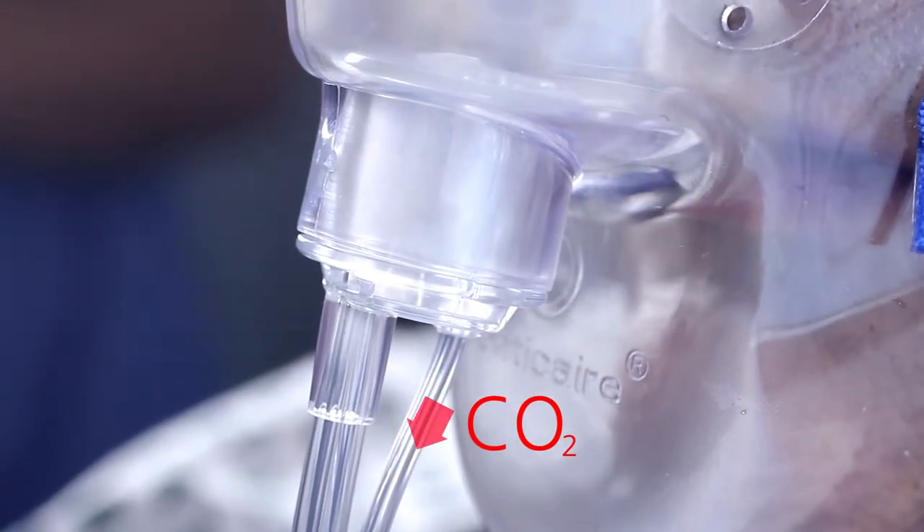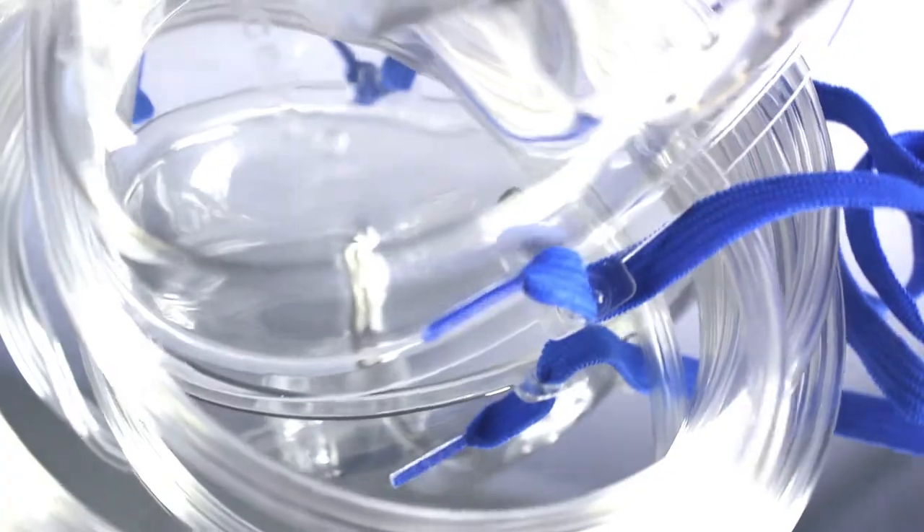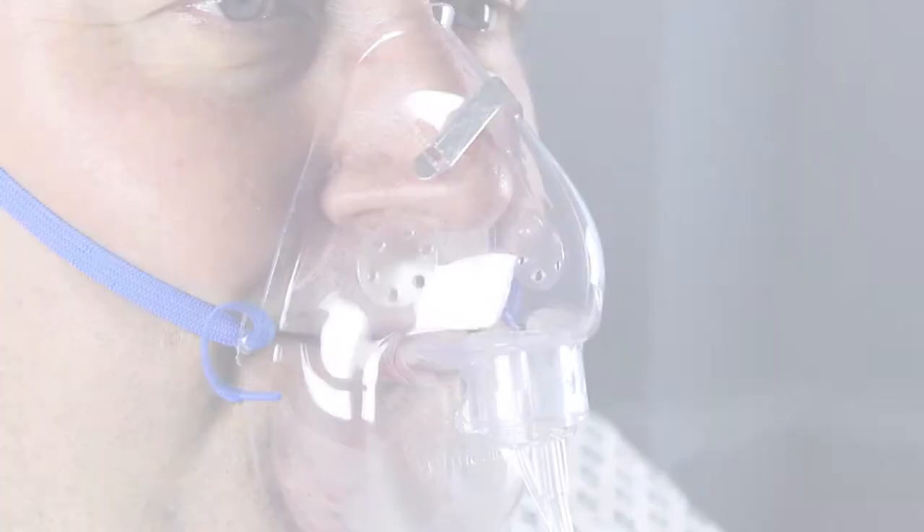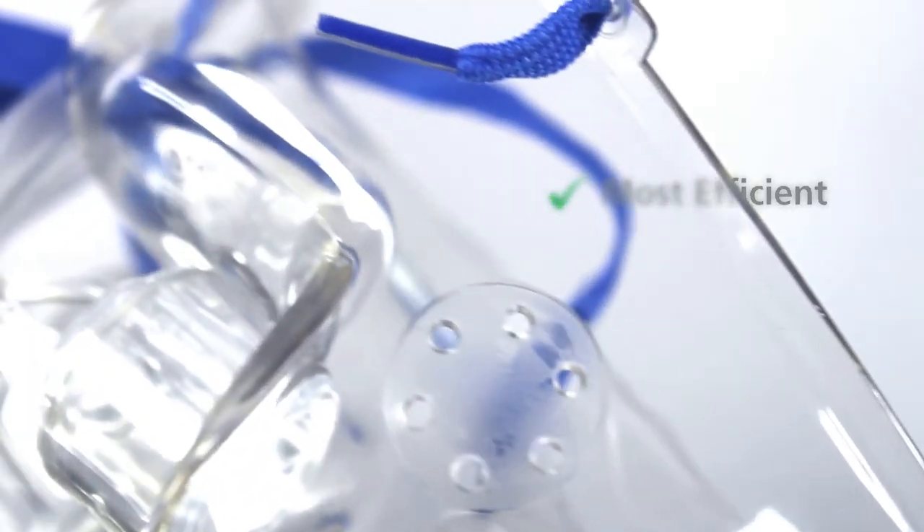The dual oxygen mask provides continual monitoring of carbon dioxide being exhaled from the mouth and nose, whilst administering oxygen to the patient. The integrated oxygen and sampling line provides quick and simple operation. Adult dual masks are also available with a nose clip. The dual mask from Flexi-Care has been proven to be the most efficient in sampling end-tidal CO2.